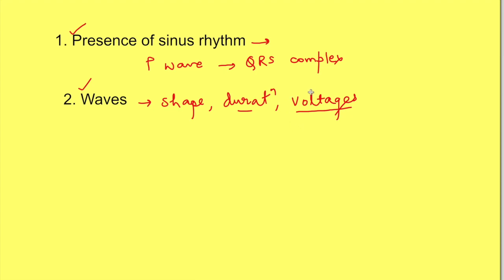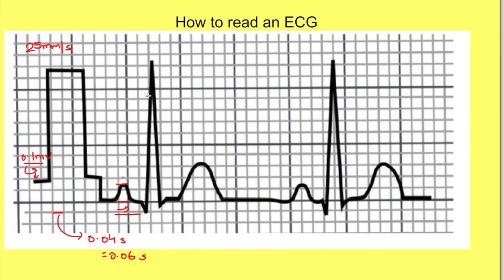To calculate the voltage of the QRS complex, take the most positive wave — in this case the R wave — and count the number of squares from the baseline. For example, 12 squares gives 1.2 millivolt. Then take the most negative wave — here Q wave is more negative, say minus 0.1 millivolt. Take the algebraic sum: the voltage of the QRS complex will be 1.1 millivolt.